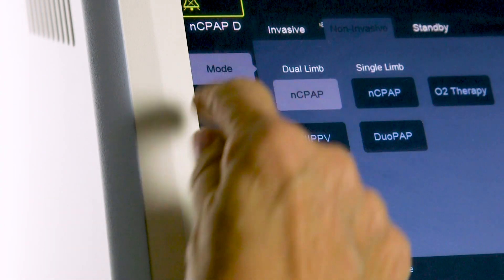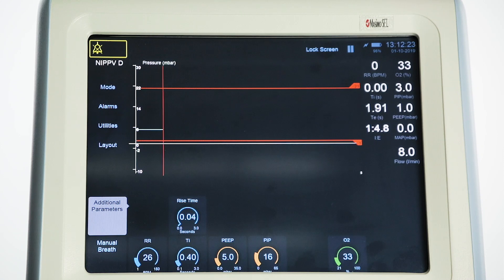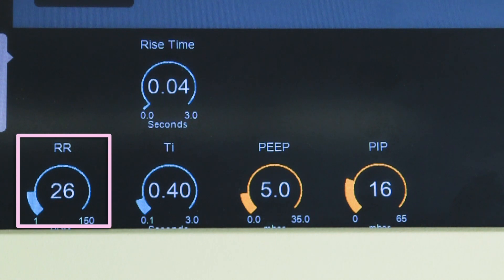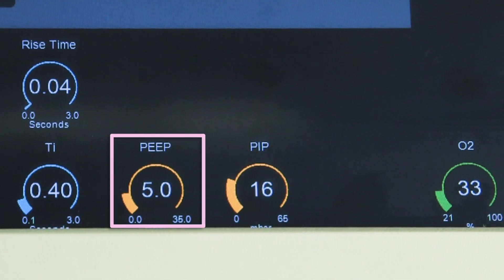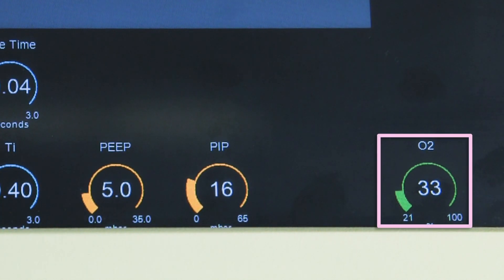Dual limb NIPPV. Select mode, select NIPPV — nasal intermittent positive pressure ventilation. In this mode the ventilator generates a continuous positive airway pressure at a level set by the user and also provides at a fixed rate ventilation at user-defined positive pressure. On the screen the user will set: RR, the ventilation rate; TI, inspiratory time, for fixed rate ventilation and manual breaths; PEEP, positive end expired pressure; PIP, peak inspired pressure to be delivered; and O2 percentage to be delivered.